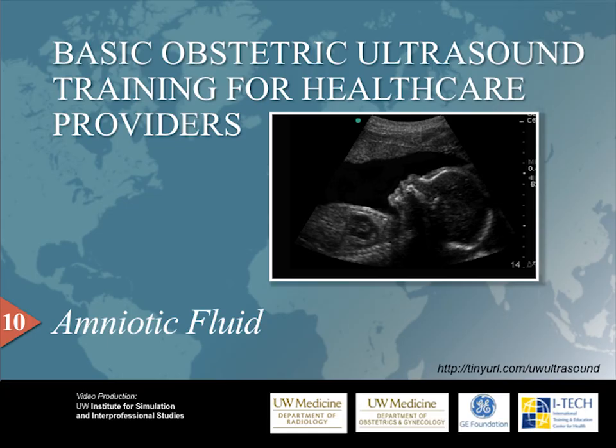My name is Dr. Christina Adams-Waldorf, and I will be narrating this 10th video in our Pregnancy Ultrasound series. This video will focus on the amniotic fluid. Please visit our website for access to all of our video and training materials.